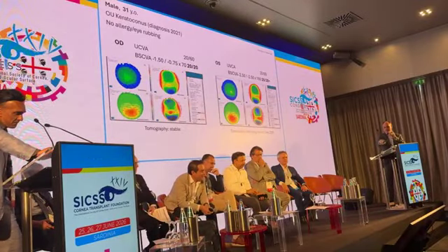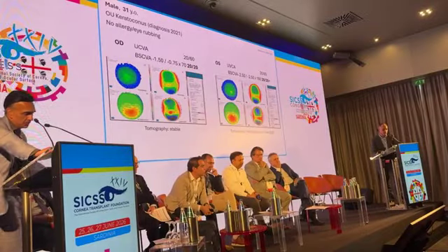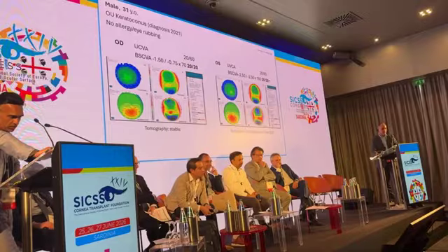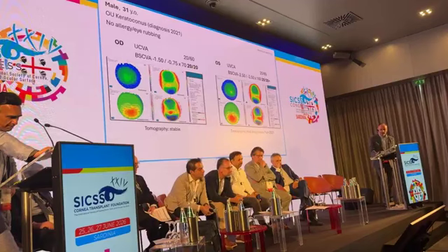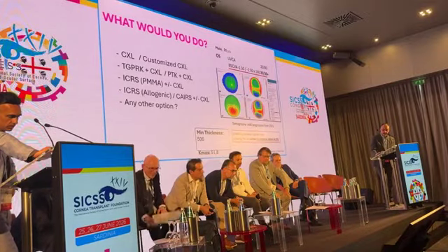I think it is very exciting, and we will also come back in the cases. So the first patient is a 31-year-old male, has keratoconus in both eyes, diagnosed in 2021, is not known with allergy or eye rubbing. You see here the tomography of the right eye is stable, and the left eye has shown mild progression from 2021. He is unwilling to wear contact lenses and is looking for an option to improve vision in the left eye. What would you do? Which one of these options, or would you do something else?